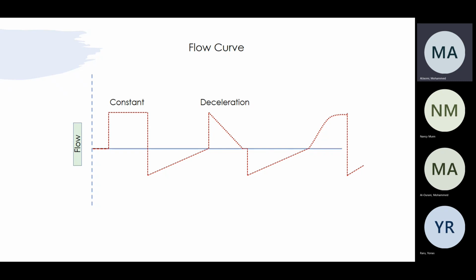So let's skip. That's a good question, but that's okay. Deceleration or constant? No difference, because the expiration is... He changed his mind. Okay, so for COPD, it is constant.